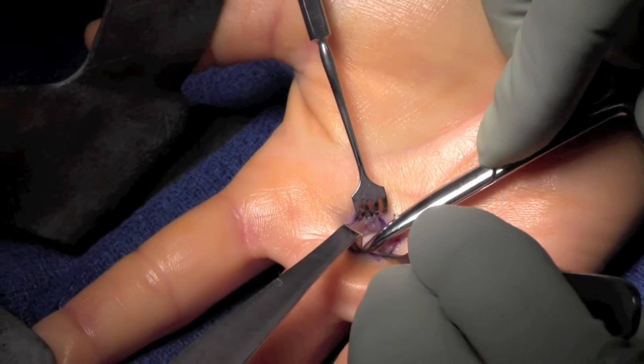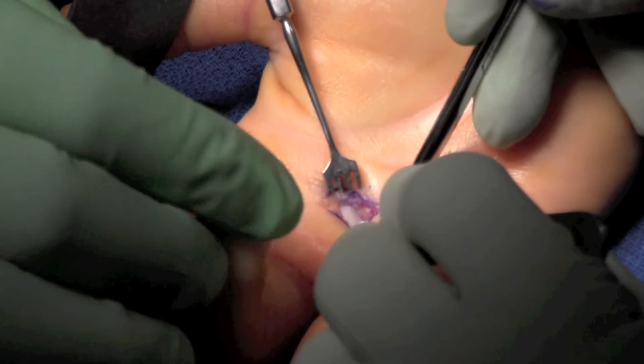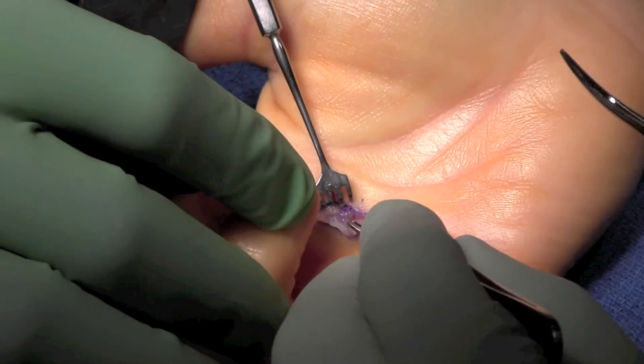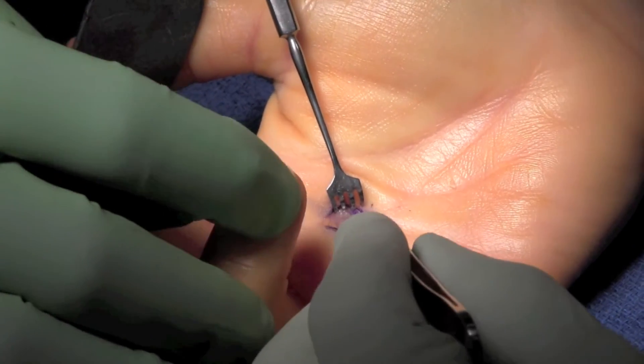Once the limbs have been identified, we then use scissors to proximally and distally release the pulley. At this point, you can see the tendon is flexed and extended. There's no evidence of adhesion.